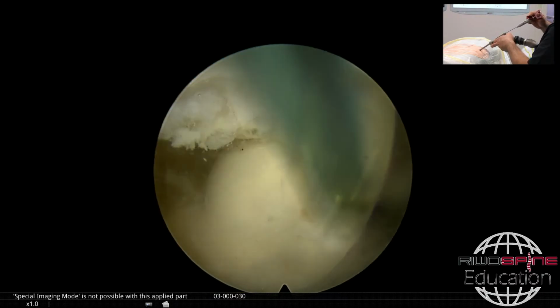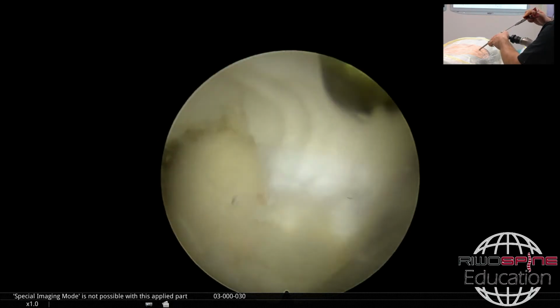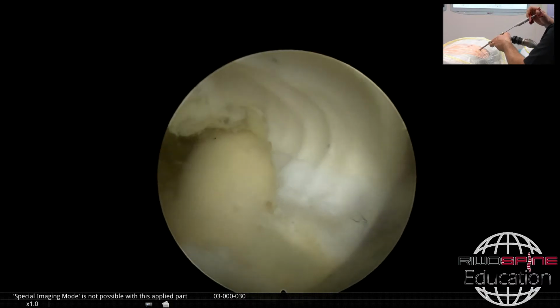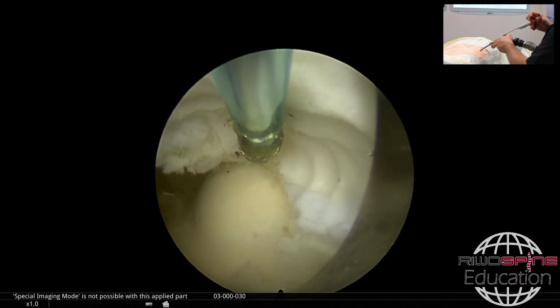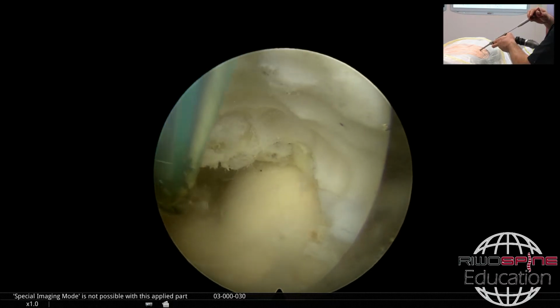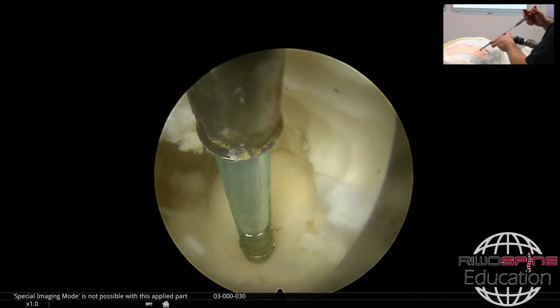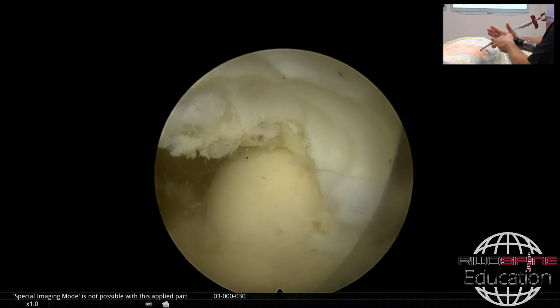Okay, now we are at the left side of the model. That means 3 o'clock is the caudal side, and I can feel the pedicle here. This is the pedicle. Already I drilled a little bit from it. And this side is the facet joint, the posterior part of the spine. And this side, the 9 o'clock, is the cranial side. And here at 6 o'clock, you see the disc space. Then, of course, this is straight up.